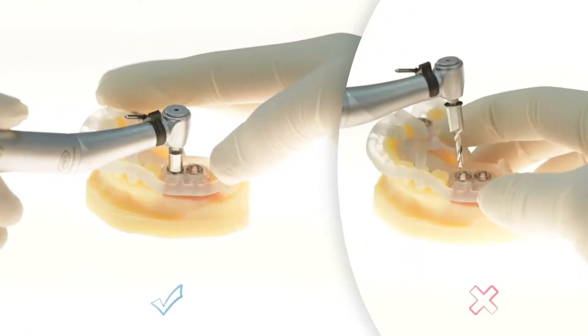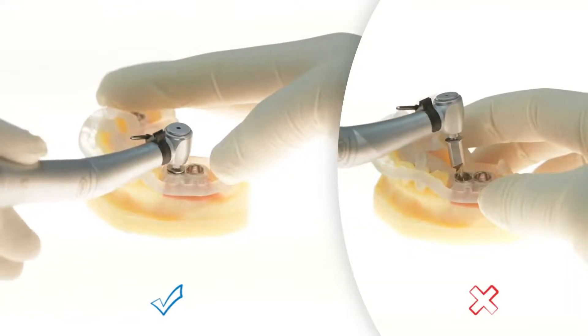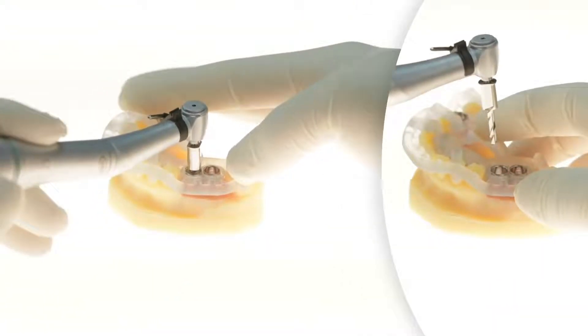For example, we can see how jumping to a 13 mm pilot drill without using the starter first may cause issues and inaccuracies.